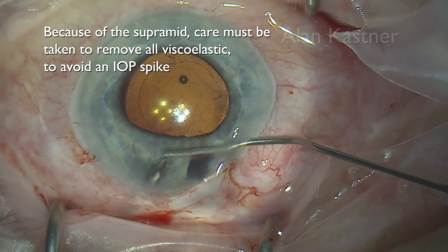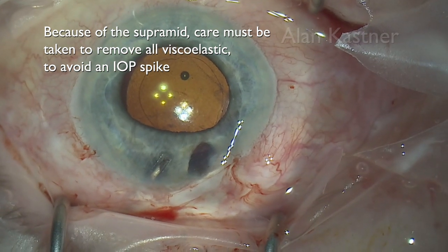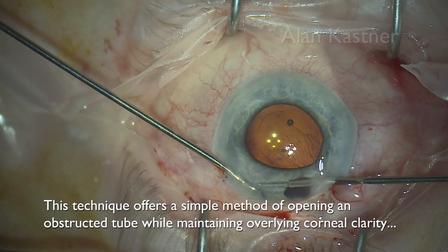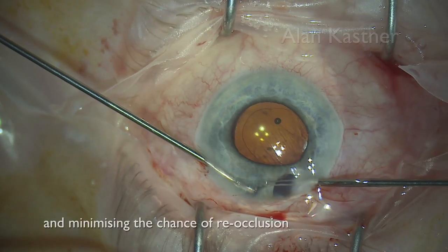Because of the supramid, extra care must be taken to remove all of the viscoelastic to avoid a post-operative IOP spike. This technique offers a simple method of opening an obstructed tube while maintaining overlying corneal clarity and minimising the chance of reocclusion.